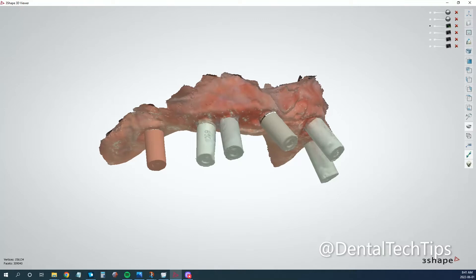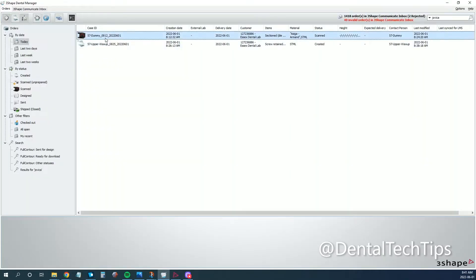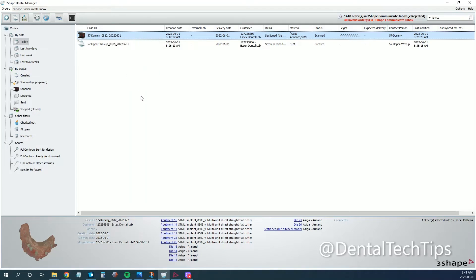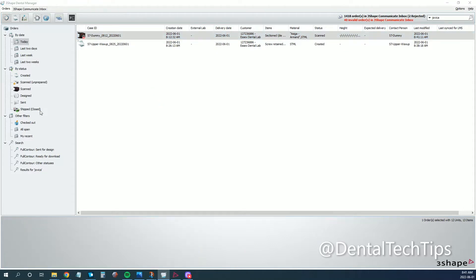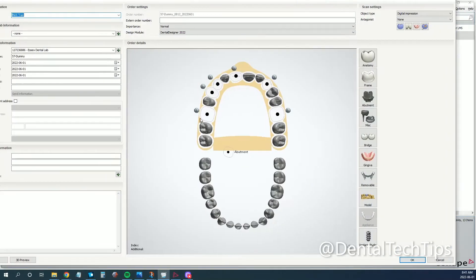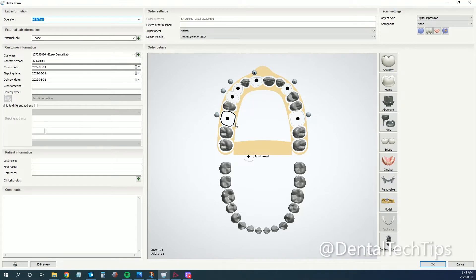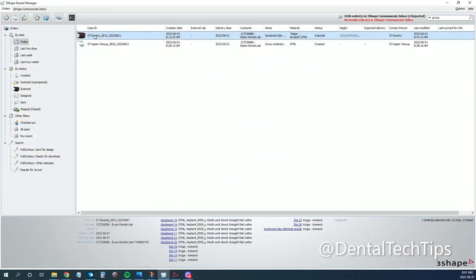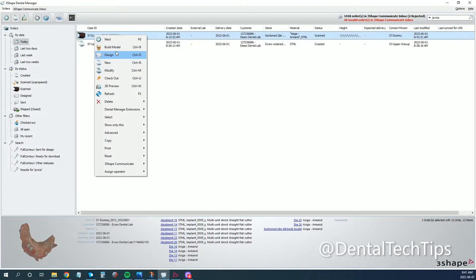The way we get around that is we need to create this dummy order here — I've already done it and realigned everything, but I'll show you quickly. Basically, you create an order form — this is a dummy order just so you can get implant coordinates put in. You select digital impression, select your corresponding implants, set it as a simple abutment, then select the model and hit OK. Basically you go through, do your design, and you align those scan bodies.